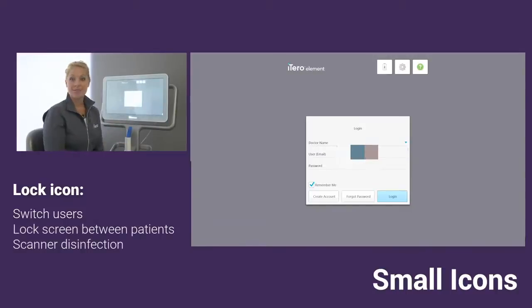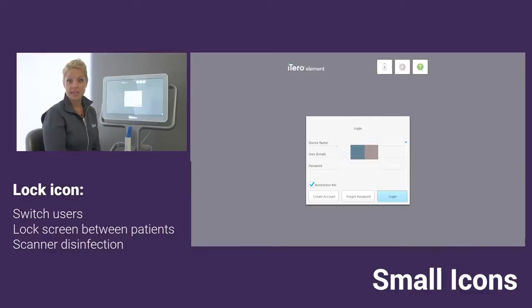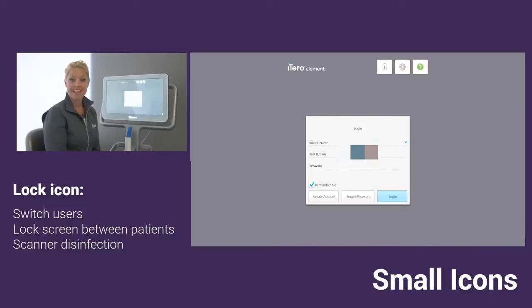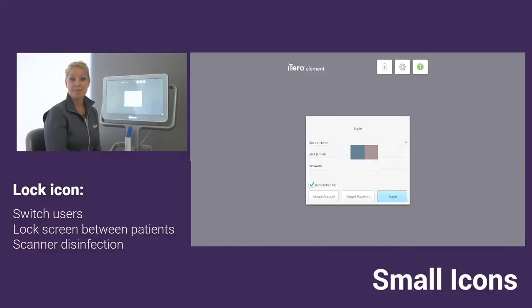In addition, a lot of times offices like to lock the screen in between patients just for privacy. Last, when you're disinfecting the scanner and wiping down the monitor, a lot of times people will prefer to tap on that lock icon just so you don't unintentionally start opening up some of the other icons while you're wiping down the monitor.